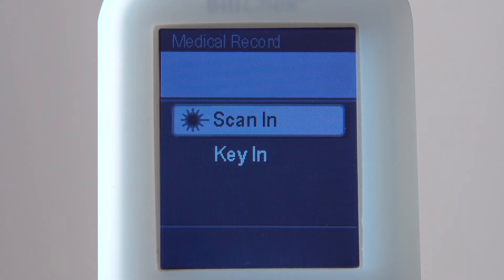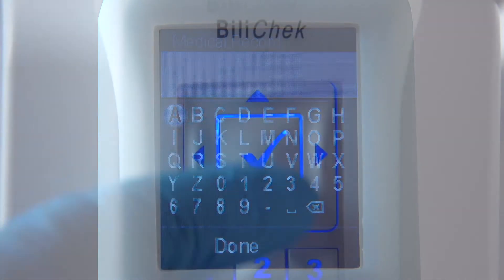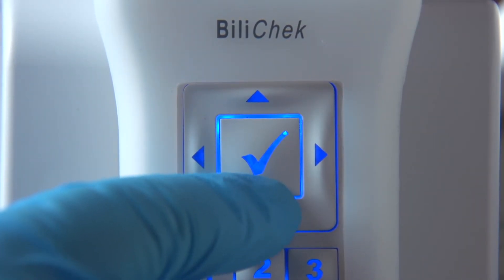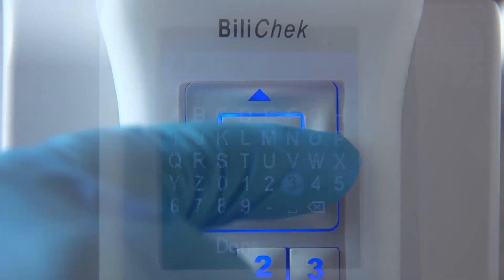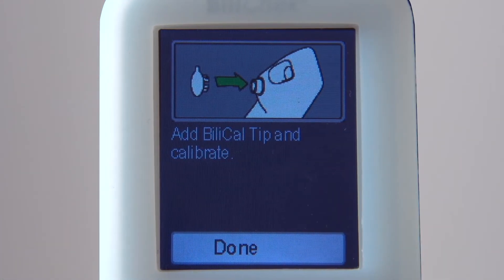If you prefer to type the information, use the arrow keys to move to the appropriate position on the keyboard and press the Enter key to select each letter or number. When finished, highlight Done and press the Enter key to save the settings.